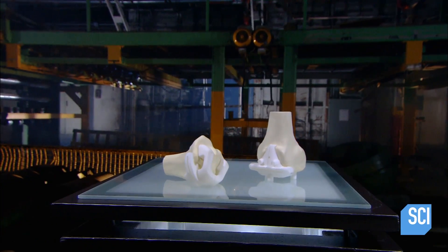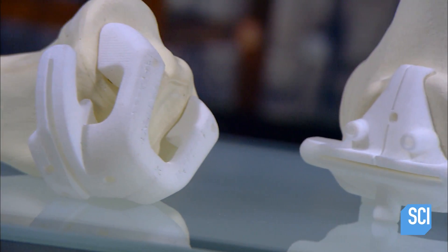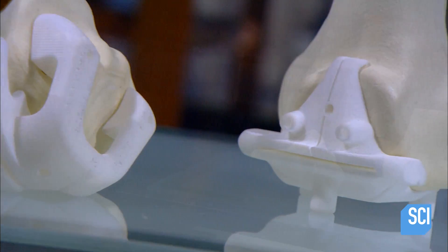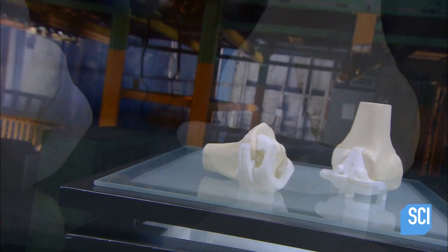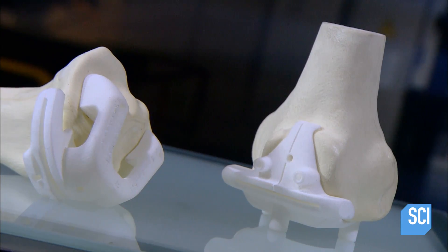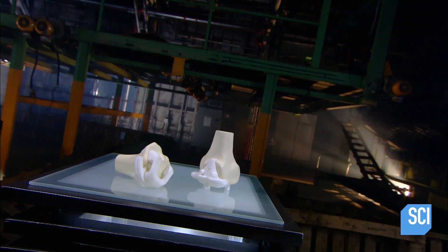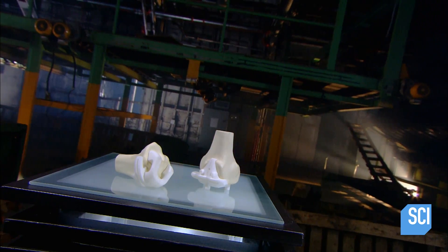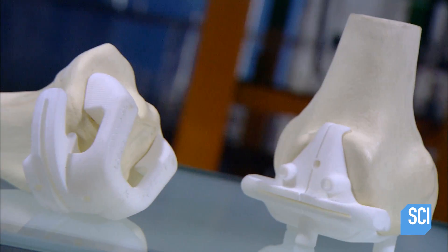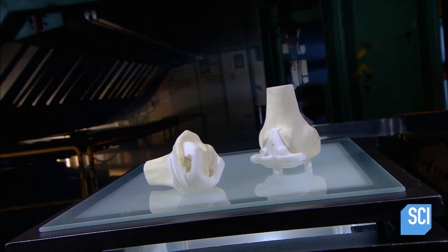The typical candidate for a knee replacement has osteoarthritis, where the cartilage in the knee has worn away. Knee replacement surgery restores the worn areas with an implant. To help place the implant properly, the surgeon can use an instrument custom designed for the patient's damaged anatomy.